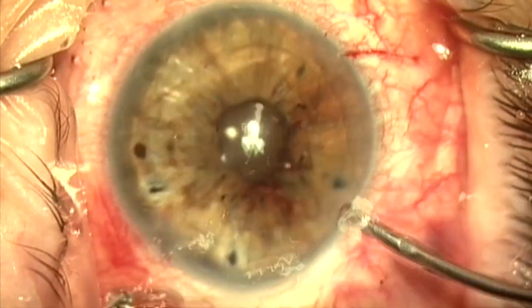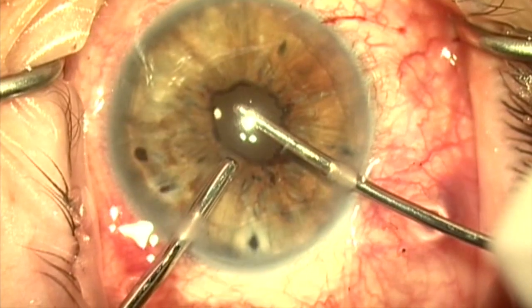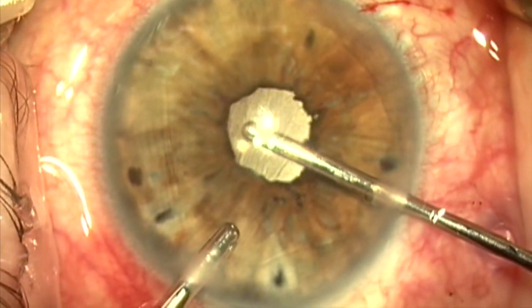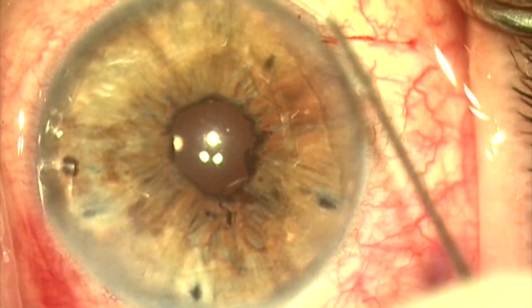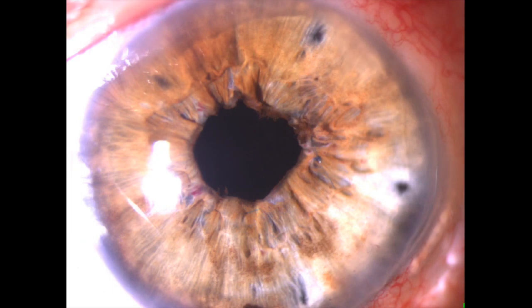We now remove the viscoelastic, and you can see the pupil looks quite good — round, with the sphincter still pretty much intact. This is a comparison of how the pupil looks compared to the beginning of the case; the patient had pilocarpine placed at the start to bring the pupil down. At day one post-op at the slit lamp, the patient's vision was 20/30, the eye looked very quiet, and she was very happy with the result.